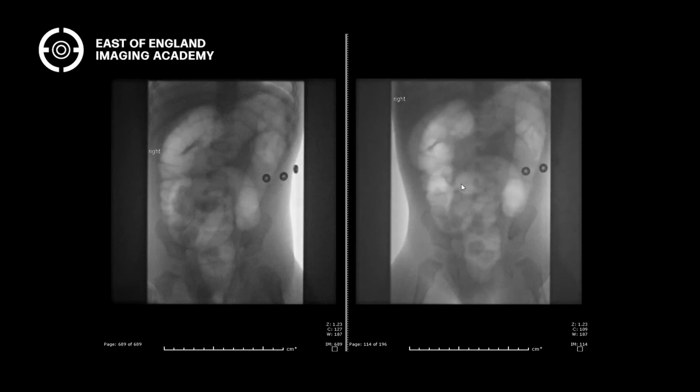When you see the intussusception, you see it, and then pop, and then you get this gush of gas going to terminal ileum. That's terminal ileum then, that's ileocecal valve. You can see it go there, pop, and then the baby goes, and they just relax, and everything's fine, and they don't need surgery. And yeah, it is honestly one of the most satisfying things.